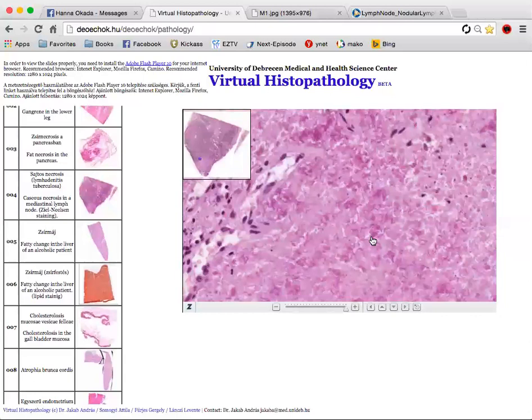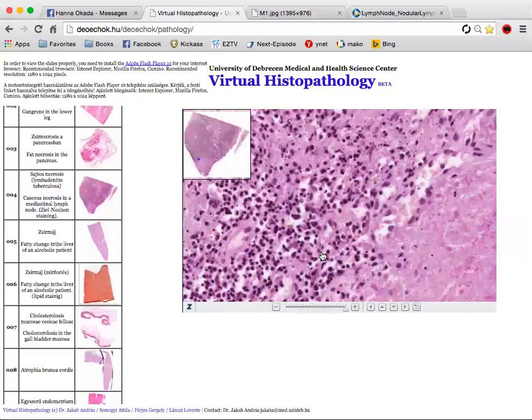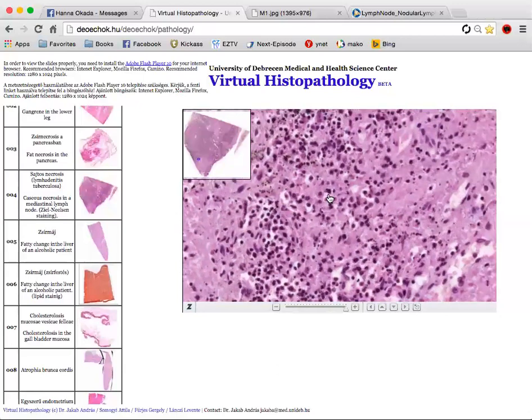And we can see no neutrophils, because this is a chronic type of inflammation. This was a type 4 hypersensitivity, so these would be macrophages and T cells. Maybe some plasma cells, but type 4 hypersensitivity, if you remember, involves macrophages and T cells.